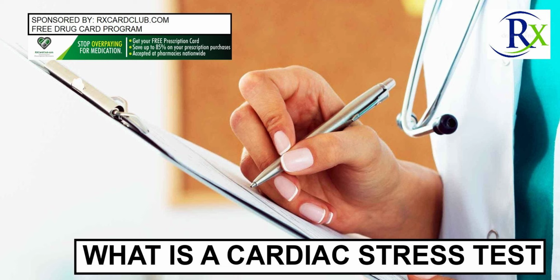When it comes to cardiac stress testing, experience and expertise do matter. Don't hesitate to get a second opinion if you are not getting the answers you need, or to ask your cardiologist to forward your records to another specialist. You can also request a copy of the results for yourself. The three main types of stress test are exercise stress test, nuclear stress test, and pharmacological, chemical, stress test by injection. The CPET, or cardiopulmonary exercise test, also measures both heart and lung function.